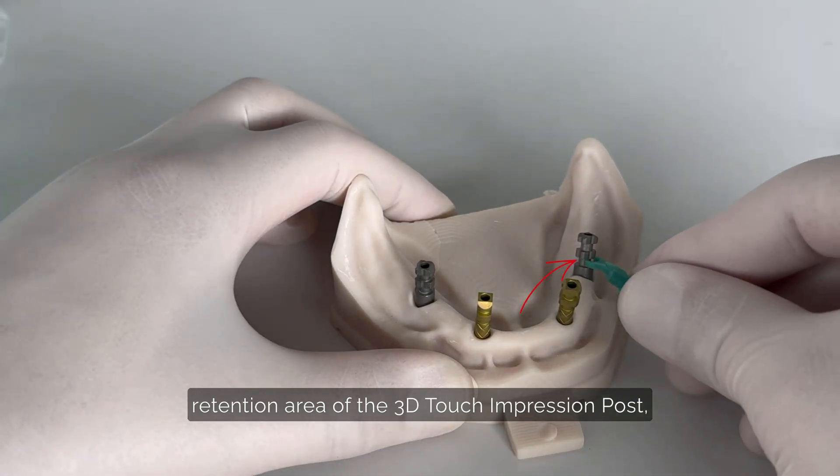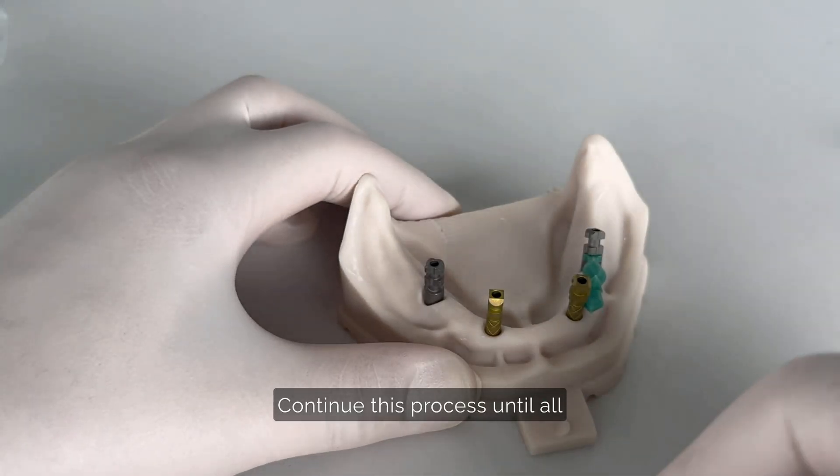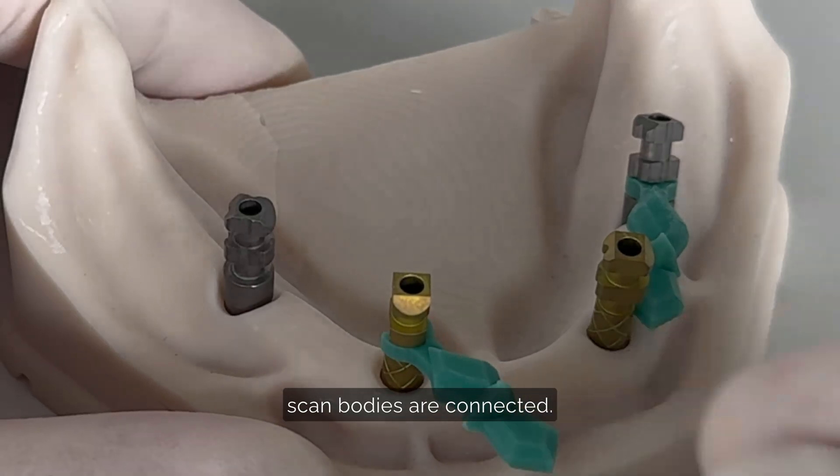Attach the first scan bridge to the retention area of the 3D Touch impression post, moving towards the neighboring scan body. Continue this process until all scan bodies are connected.